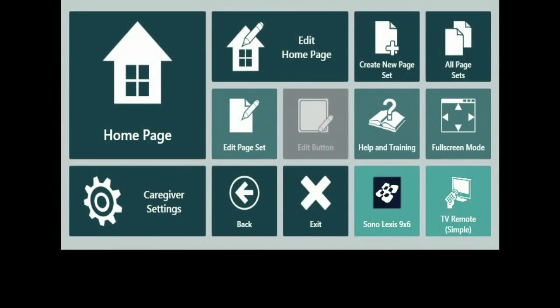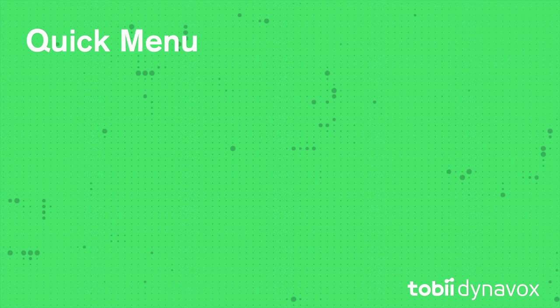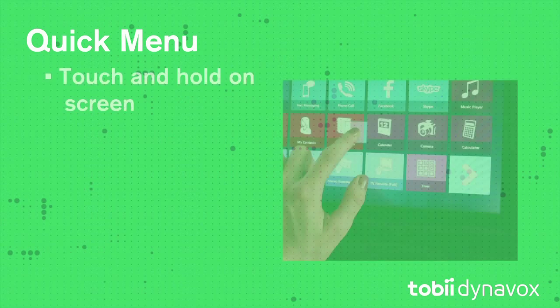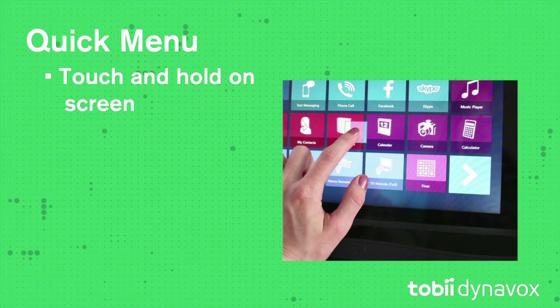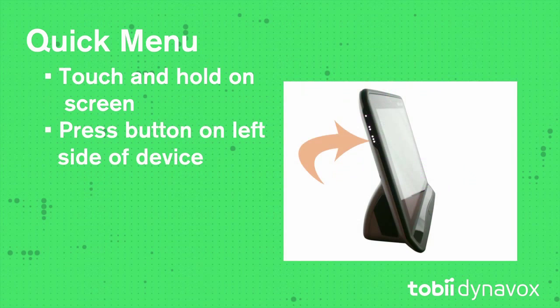This is the Quick Menu and there are four ways to access it. You can touch, hold, and release anywhere on the screen or press this button on the left side of your device.